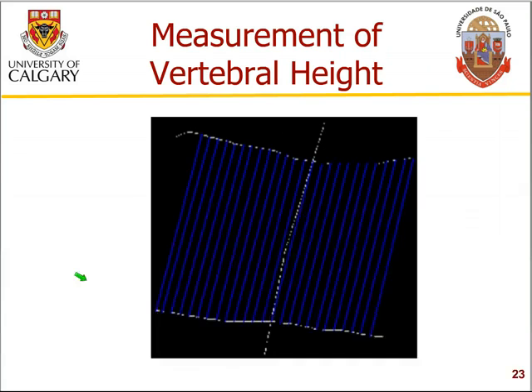This helps in making measurements of the thickness as shown in this picture, where the central part of the axis is shown here, which is not a straight line. The points of intersection of this line within this particular vertebra, delimited by the plateau shown at the top here and the bottom here.